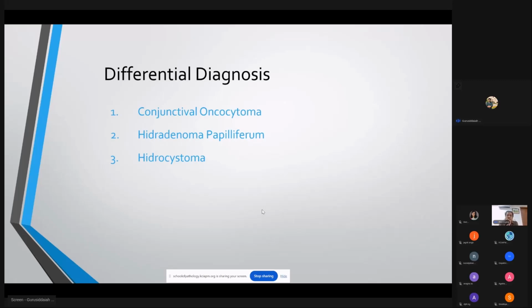layer, but the negative point here is that it doesn't have a myoepithelial layer, since hidrocystoma always comes in a bilayer. There is deep eosinophilic cytoplasm, there are decapitated secretions, oncocytic changes are seen, and there are focal proliferative changes as well as papillary projection.